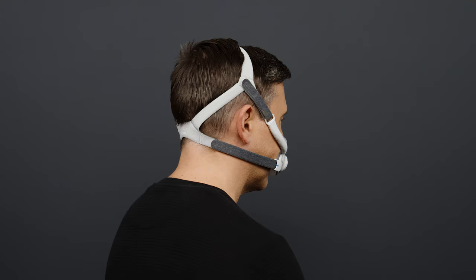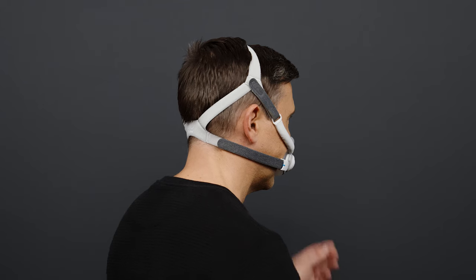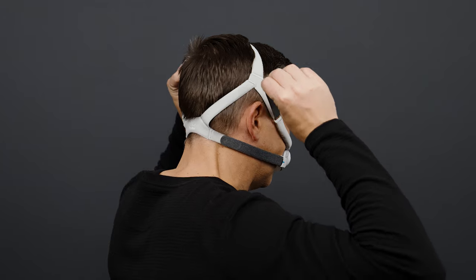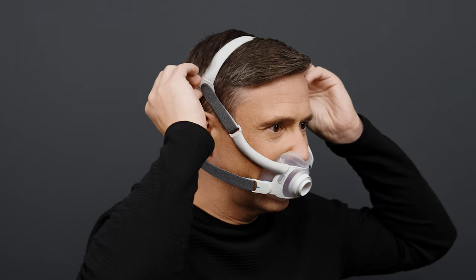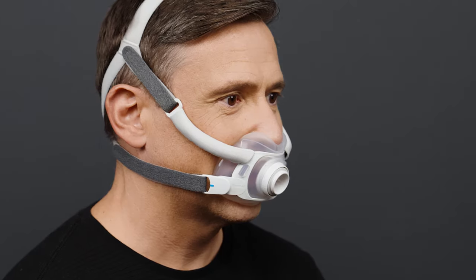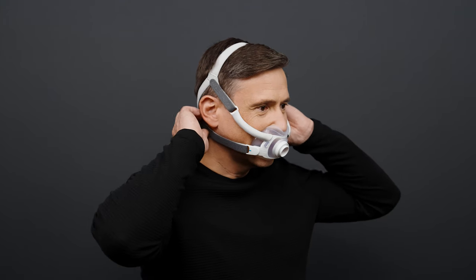If the mask feels too tight or too loose, undo the fastening tabs on the upper headgear straps and pull or release evenly. Ensure that you don't over-tighten the straps. The cushion should not push your nose up excessively. The cushion should sit comfortably and securely under your nose. Now do the same with the lower headgear straps. The mask should have a comfortable but snug fit.